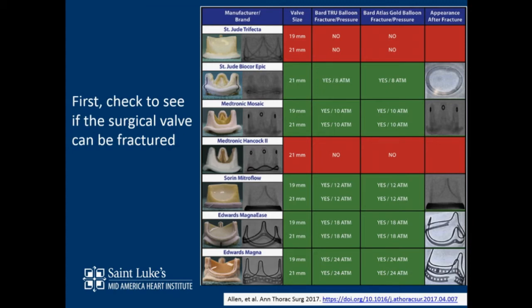I'm not really sure it's a bad argument. They say that if you're using a self-expanding valve, your gradient through the Evolut may get better, and you may avoid it. I don't think so, not with a valve-in-valve TAVR. I think that's salesmanship BS. Yeah. They describe that you need 10 minutes for the nitinol to warm and assess.